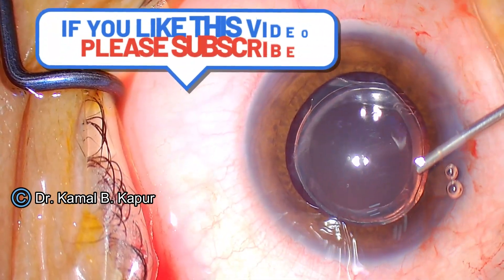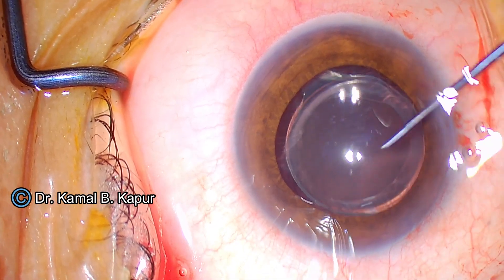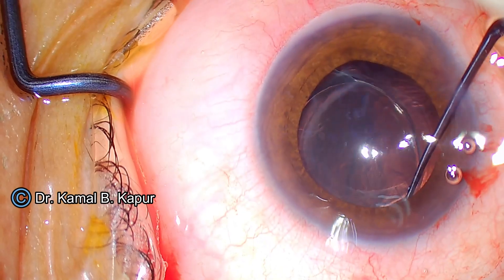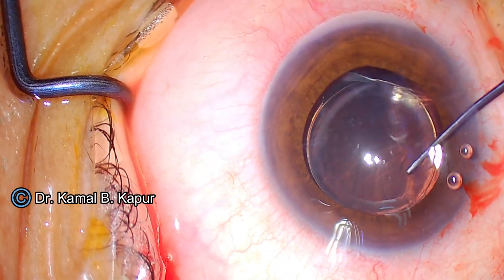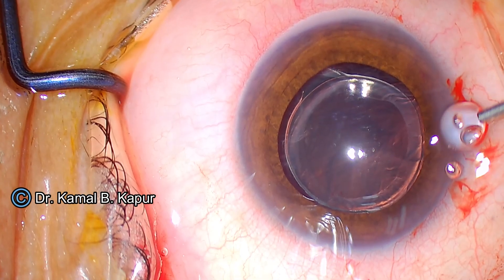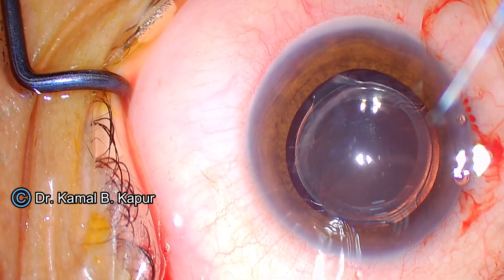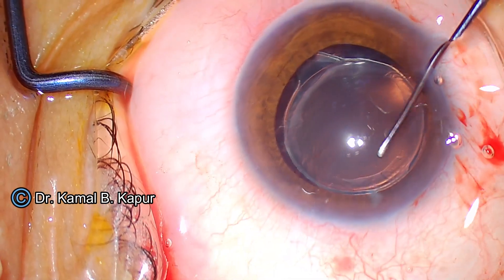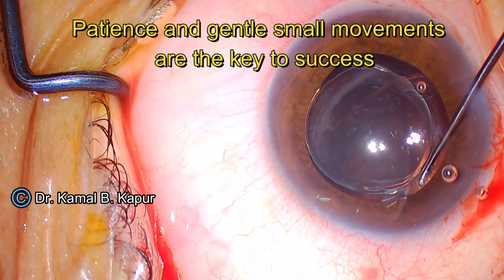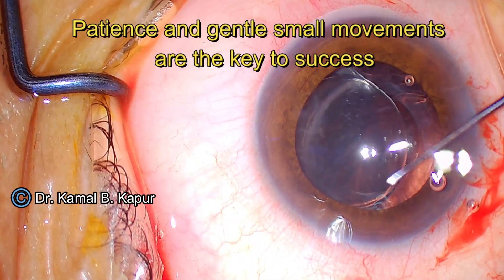You have to ensure you keep instilling viscoelastic inside, because if the anterior chamber is flattened, the whole capsular bag complex will try to vault upwards and cause problems. You can do this step even through the side port if you want to be very sure. Keep instilling viscoelastic and make sure the part of the haptic stuck in the anterior and posterior capsule is free.